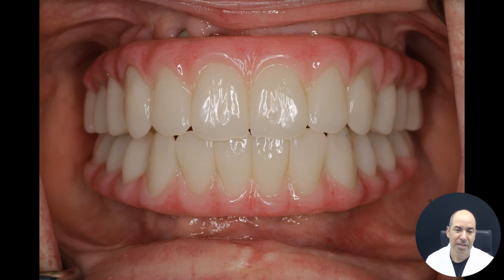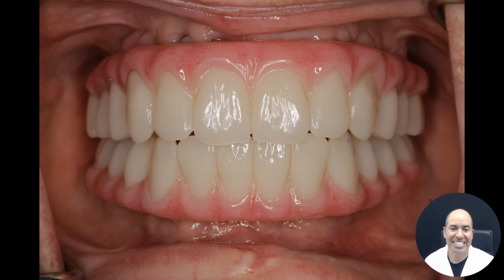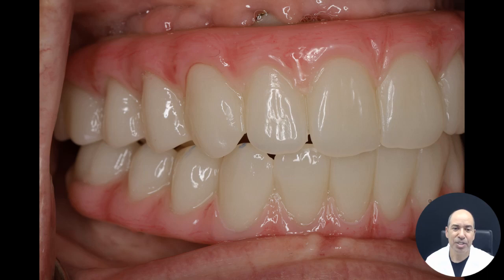These are all designed by my lab partner and I for really custom results, not just a one size fits all, a small, medium, or large, and male or female, right? So there's a lot that goes into smile design. So these are the new prototypes.